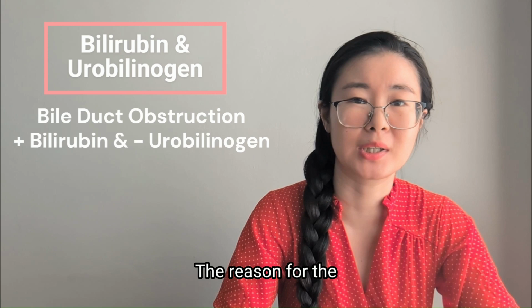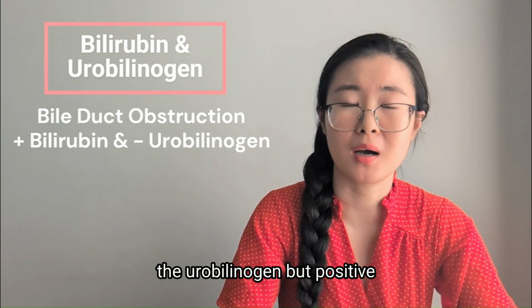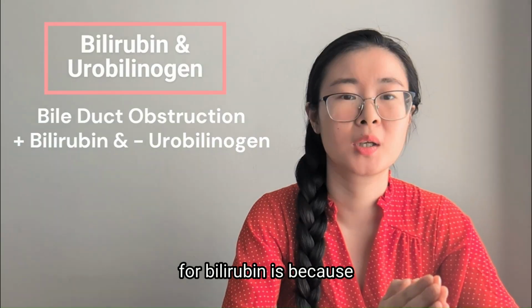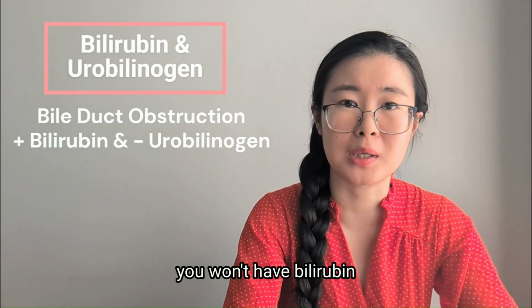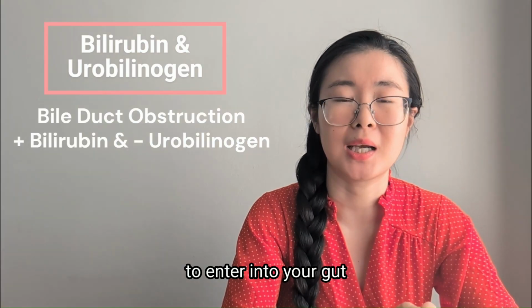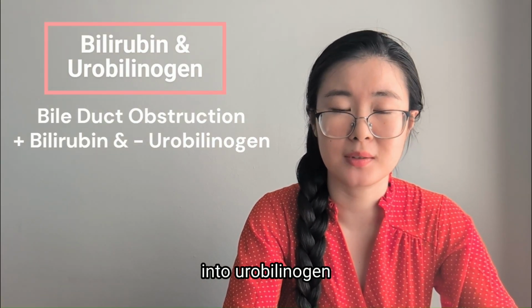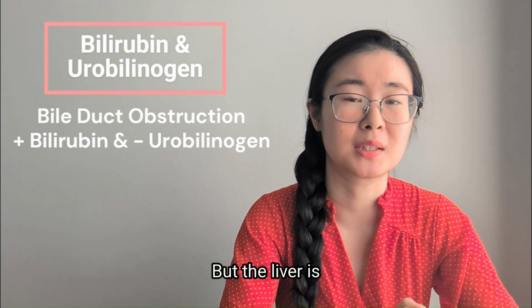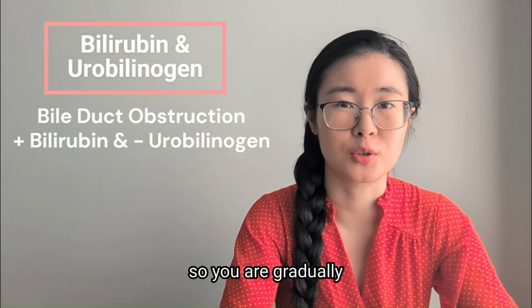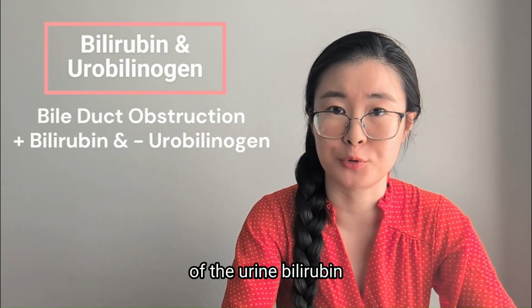The reason for the negative or normal urobilinogen but positive bilirubin is because when the bile duct is obstructed, you won't have bilirubin entering into your gut and then being processed by the gut bacteria into urobilinogen, so your urine won't show any of this. But the liver is still functioning normally, so you are gradually having a buildup of the urine bilirubin.